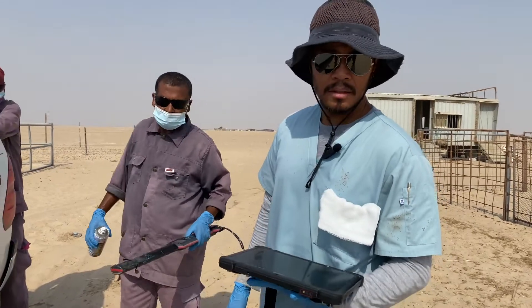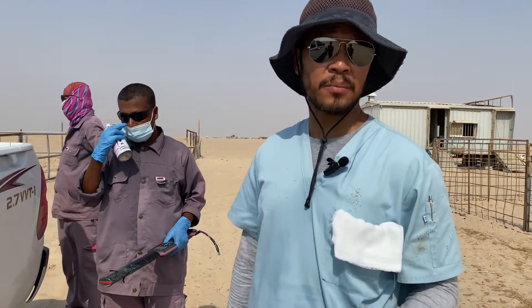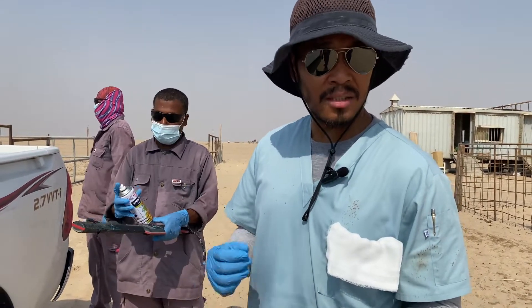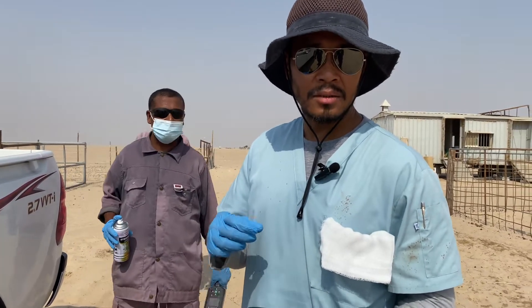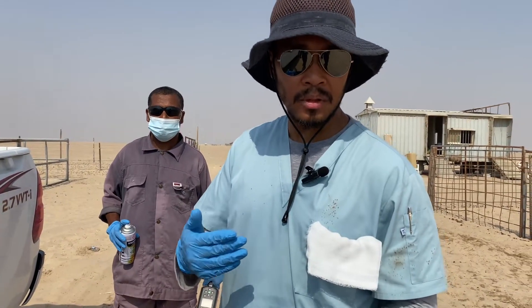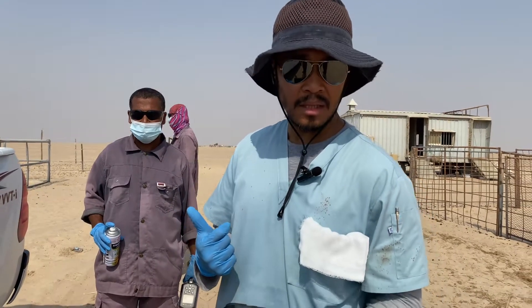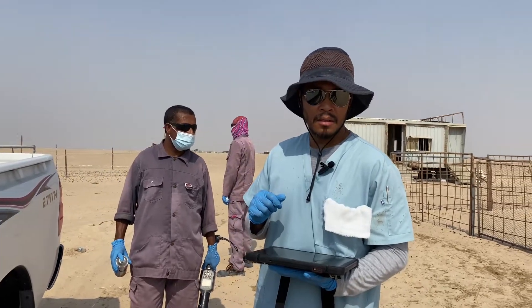Hey guys, so this is part 2 of animal registration. I'll teach you how to microchip camels. The last time that we did it, you didn't see how it's put in the camel. So this time I'll show you a close-up look on how it's done. We have 14 camels that we need to identify and put microchips on them. Alright, let's go.